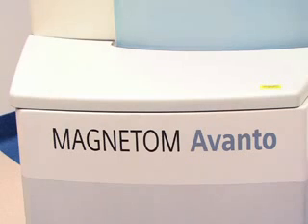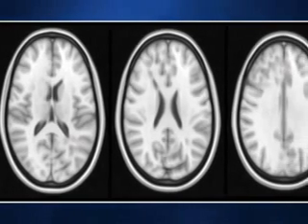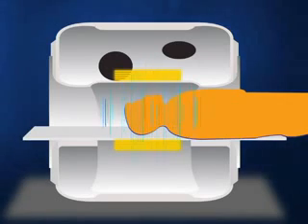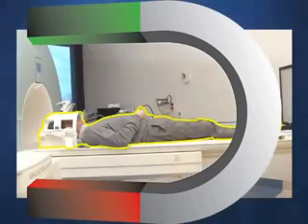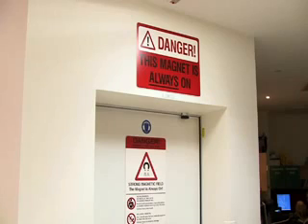MRI is a diagnostic method for generating cross-sectional images of the human body. This method is based on the interaction between the human body and powerful externally generated magnetic fields. An MRI is fundamentally a giant magnet, extremely powerful, requiring strict adherence to safety procedures when within its proximity.